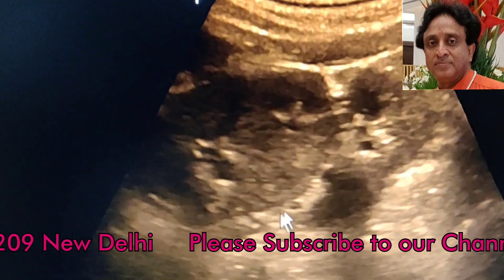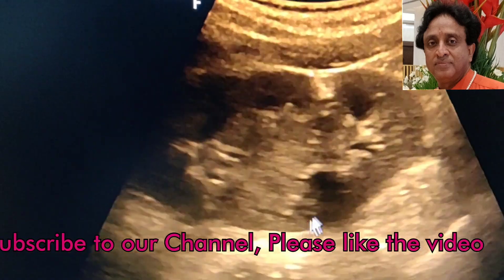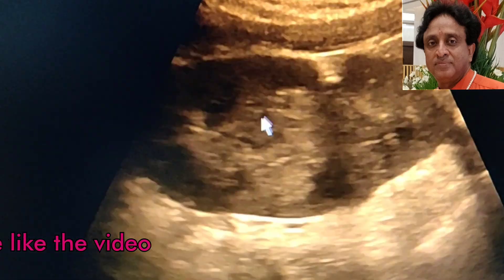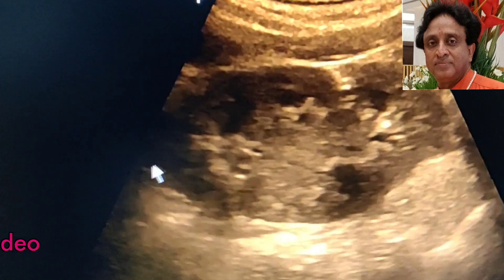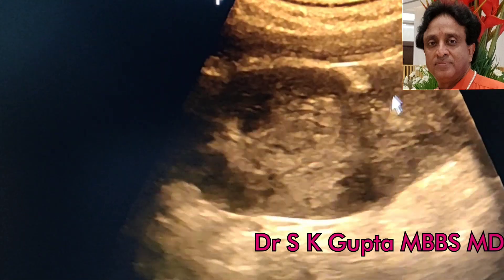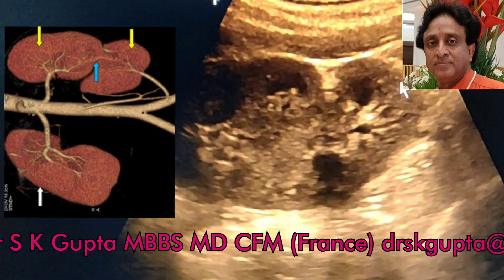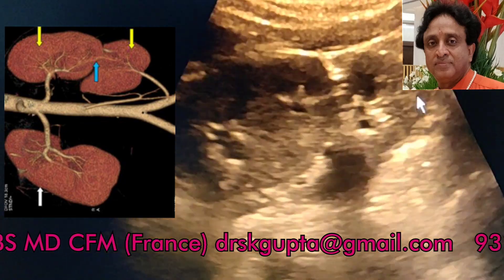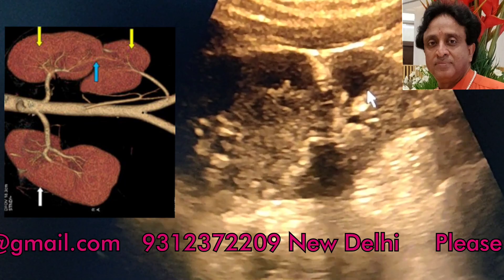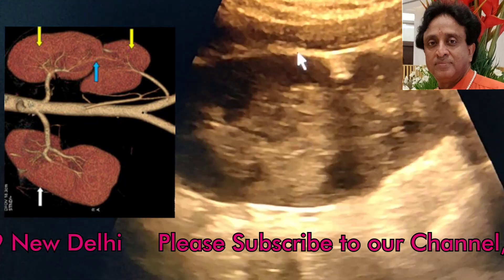This is the left side of the patient and you can see there is a kidney here — the whole kidney can be seen — and there is another kidney-like shadow at the lower pole of this kidney. The main kidney has an axis like this, and the other kidney attached to the lower pole has an axis which is perpendicular to the left kidney. This is the supernumerary kidney, which is fused with the main kidney at the lower pole at a perpendicular axis.